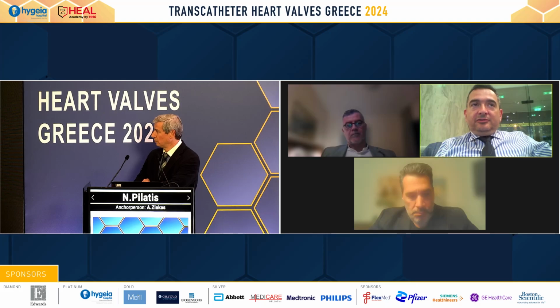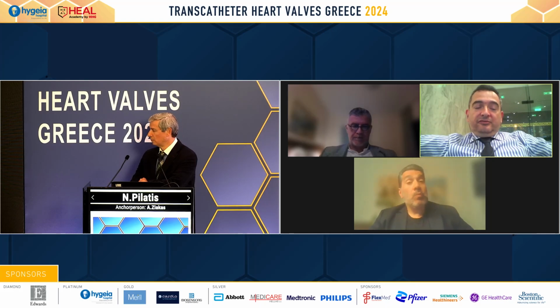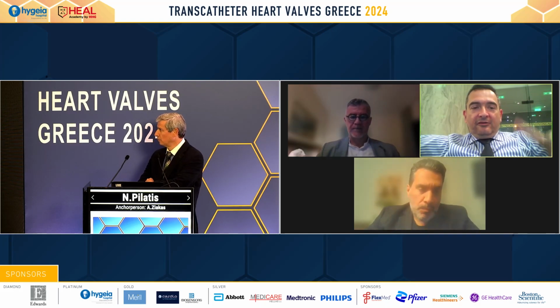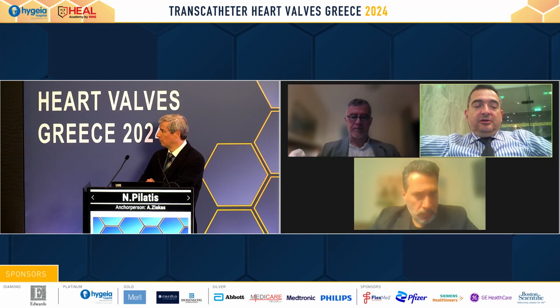Because at the beginning, after the release of the stenotic aortic valve, the good working of the left ventricle elevates the velocity of the aortic valve, and in about 1 month or 3 months, everything is going to be normal, with a normal flow, with a normal diastolic function of the left ventricle, from the moment that the sclerotic aortic valve is off now. This is to remember that after the implantation, it is not uncommon to find big velocities, and to normalize these velocities after a month or 2.